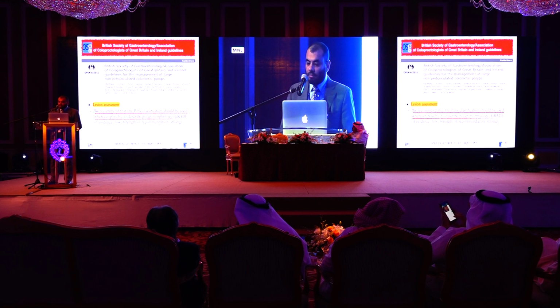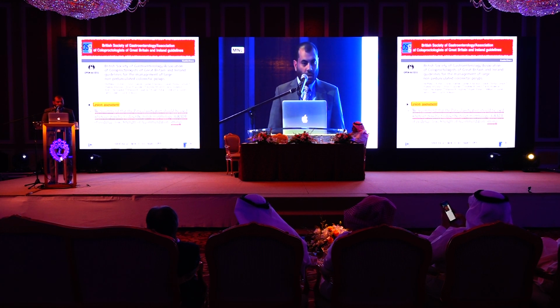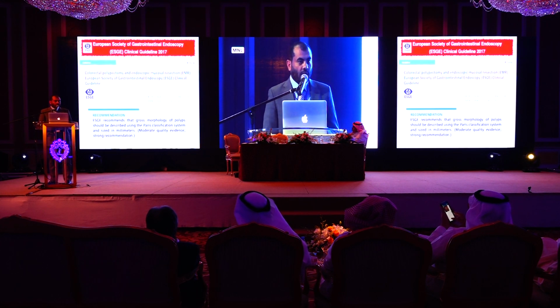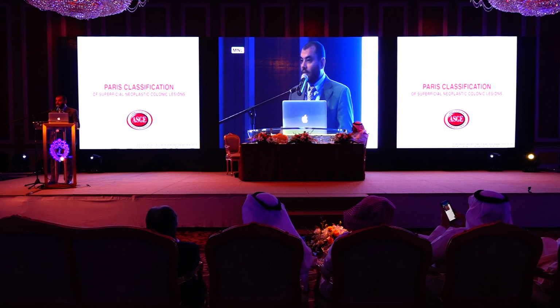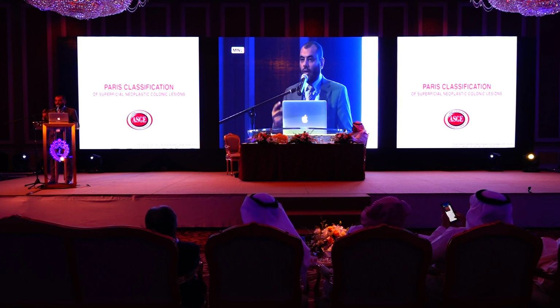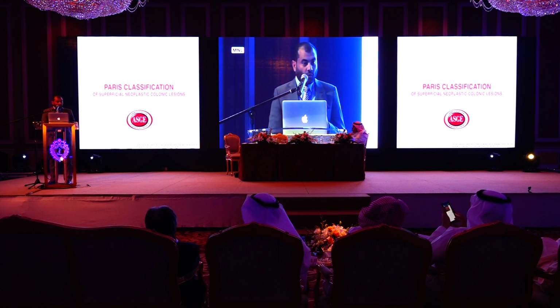As strongly recommended by the Great Britain and Ireland guidelines, whenever possible, describe any colonic polyp by using the Paris classification system. It was also the first recommendation of the European Society for Gastrointestinal Endoscopy guidelines 2017. Lesion morphology is very important, as mentioned in the previous British and European guidelines. The Paris classification can identify lesions with increased risk of malignancy and when we can refer the patient for surgery. According to guidelines, there is no excuse for any endoscopist not to describe the lesion morphology by using Paris and to mention it in his report.